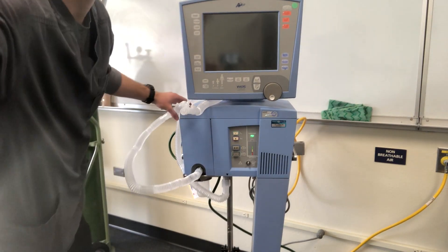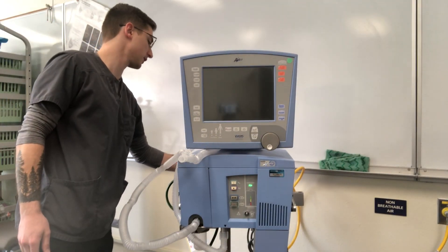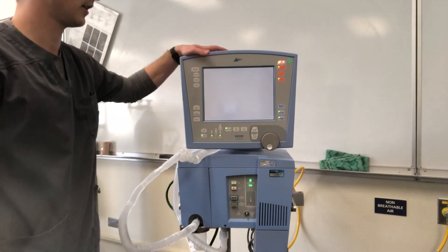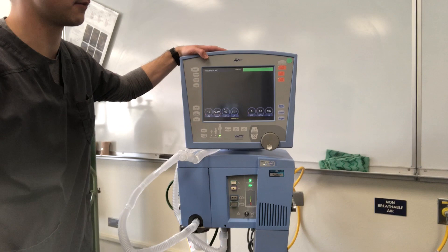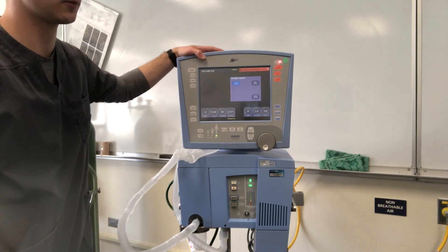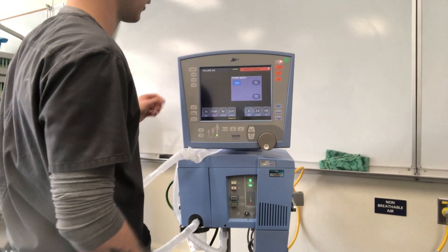The power button for the Avea is on the back of the unit — it has a little flip switch. The Avea will alarm when it turns on. At this point we have medical gas plugged in; we do not have oxygen on campus and we'll get to that.